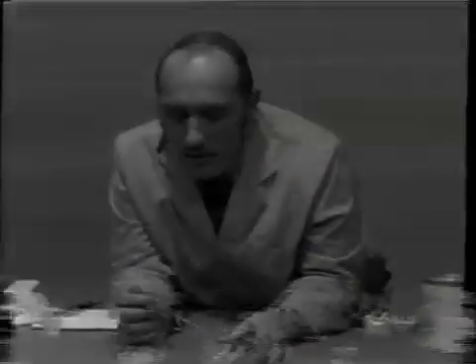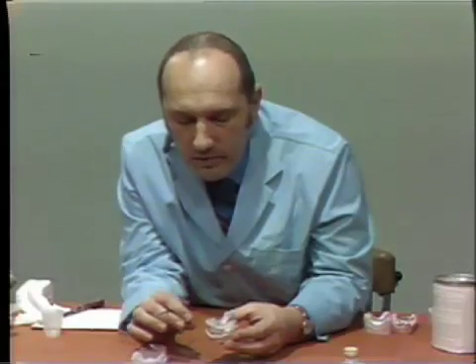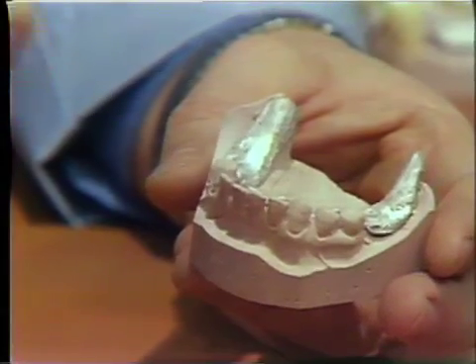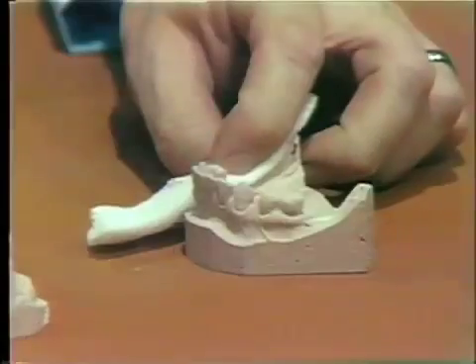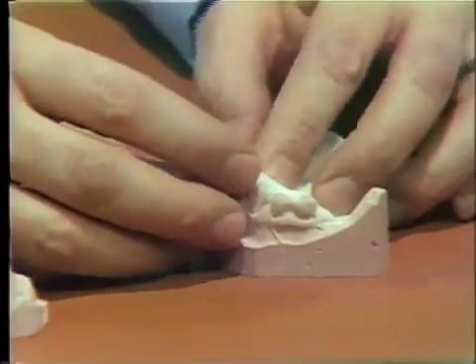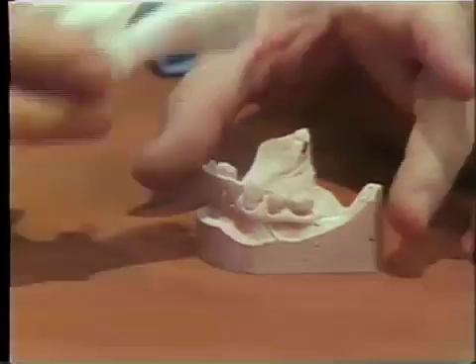It's wise to prepare the patient for the type of impression to be taken. It's very important that the muscles and all the soft tissues are at complete rest. Try the tray in several times and instruct the patient to relax, think peaceful thoughts, and close their mouth so their lips just touch but their teeth are not touching. Do this three or four times. Then take strips of two-by-two gauze, open them up, and place a strip in the buccal vestibule and the lingual next to the tongue — four of these, all sticking out in front so you can pull them out quickly before placing the tray, ensuring no residual saliva.